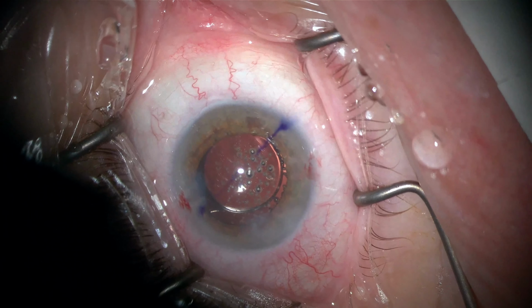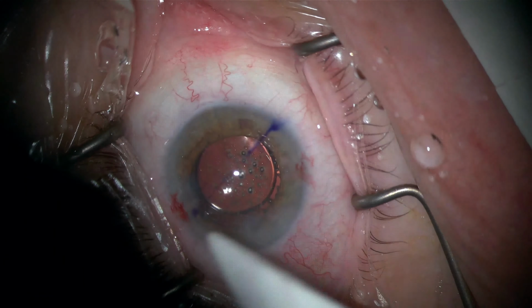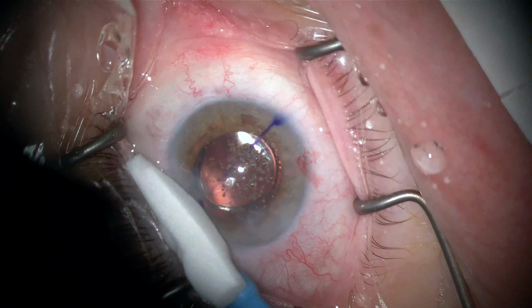Here I inject intracameral moxifloxacin and check the incisions a couple of times and get the IOP just right.